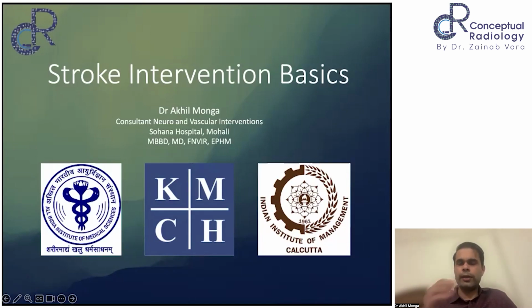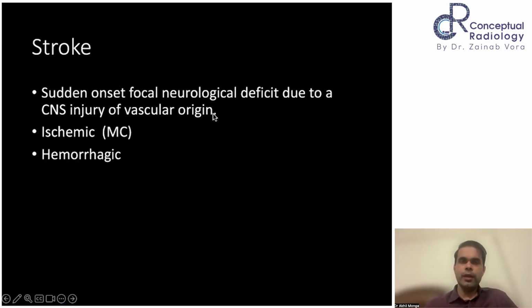I have 4 or 5 cases in this lecture as well, just to show in the end. But the primary idea in stroke interventions is to know the initial imaging, the signs. I'm not sure, maybe in some of your neuroimaging lectures acute stroke might have been covered, but we'll try to keep that part intact here, which is extremely important for decision making in stroke. So of course, the basic definition has to be there.